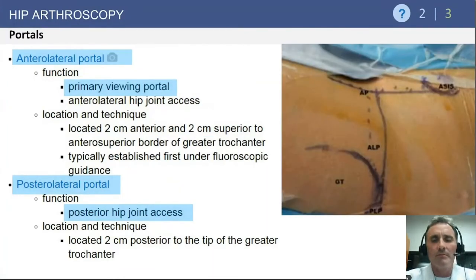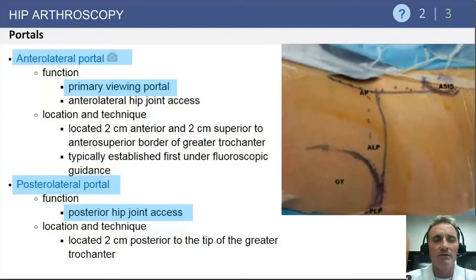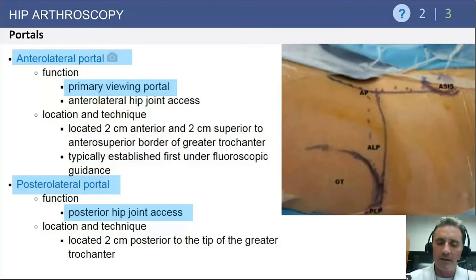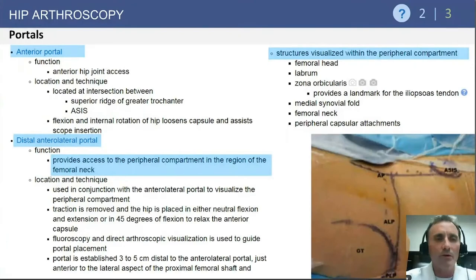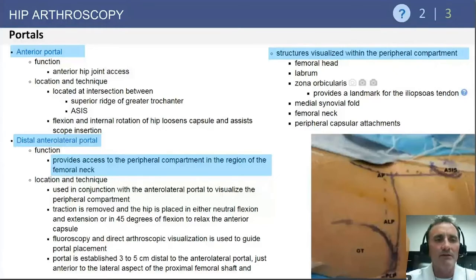Here on your monitor you can see the different portals. The anterolateral portal is off the anterolateral aspect of the greater trochanter and primarily used for visualization of the joint. The posterolateral portal provides access to the posterior hip, used for outflow as well as working along the posterior rim of the acetabulum. The anterior portal provides access to both the anterior rim, anterior labrum, lateral rim, and lateral labrum — making it the workhorse portal for the majority of hip arthroscopists.